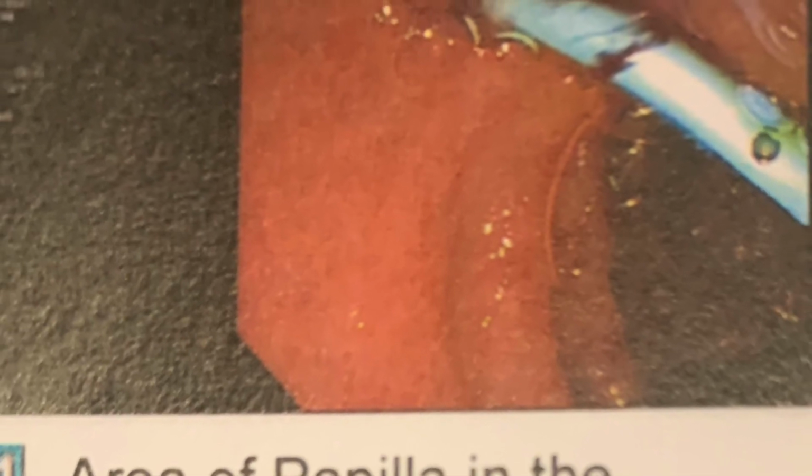Stent is visible proximal to the ampullary carcinoma site, successfully placed and draining clear bile, with successful decompression achieved in an elderly patient with ampullary carcinoma.